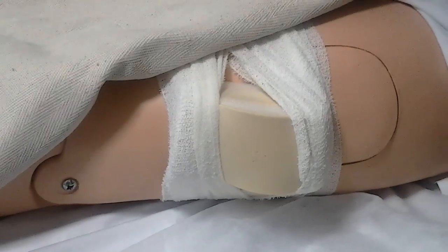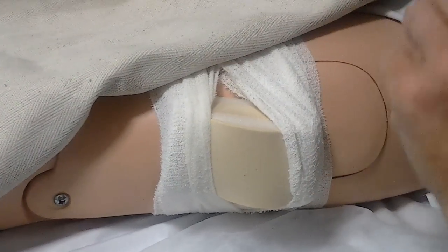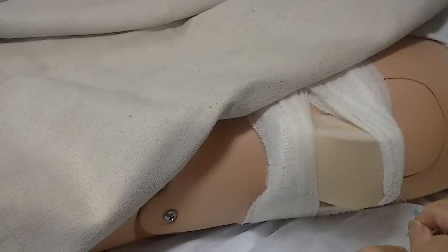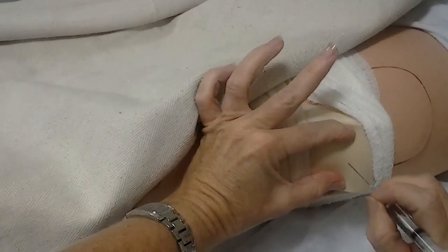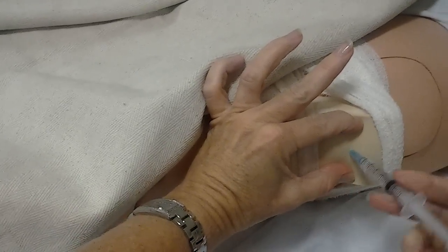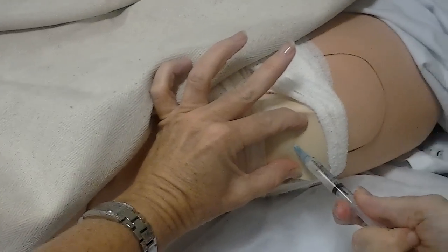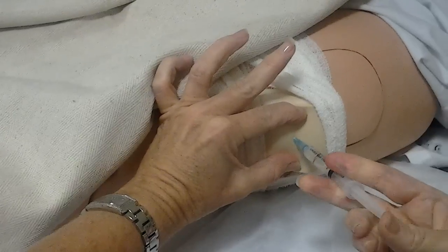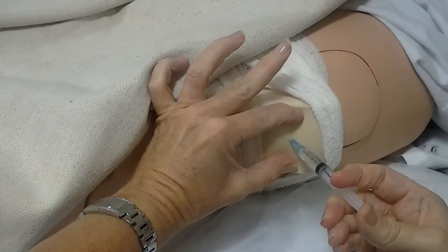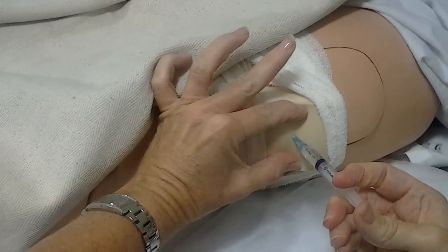Hold the skin taut to flatten the subcutaneous tissue and inject at a 90-degree angle. Aspirate the plunger to ensure you are not injecting into a blood vessel, and then slowly inject over several seconds until medication has been fully injected.